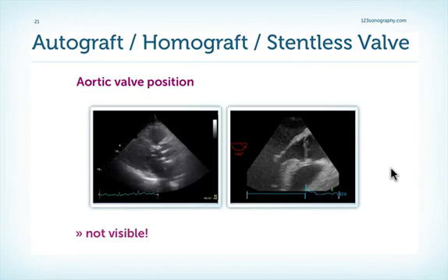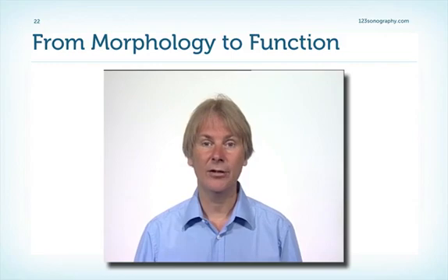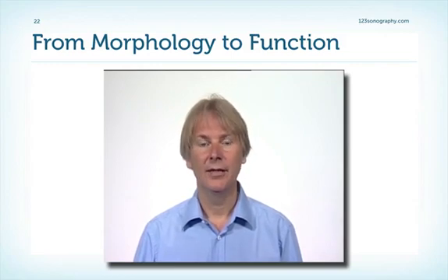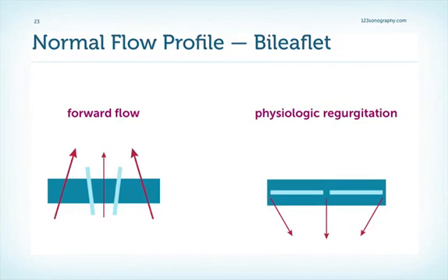So you saw the superb image quality that we get with modern echo machines gives us a lot of morphologic information about prosthetic valves. But not only morphologic information, but also functional information. Up front, I would like to show you the typical flow profiles of the various prosthetic valves.